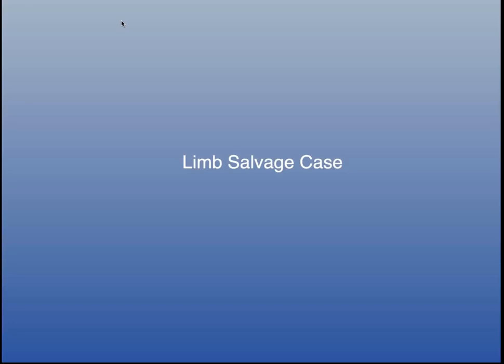But our model is, I typically don't have CTAs or MRAs unless I'm dealing with iliac disease or aortoiliac disease, or prior surgery, or there's something that doesn't make sense based on what they're telling me, what I find on physical exam, and what I'm expecting based on that. I will tell you the other thing that's the most important that a lot of people don't talk about is just a good Doppler exam. If you have a good Doppler probe, it's checking out the entire vascular, a good vascular exam.